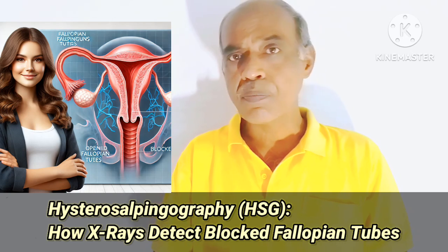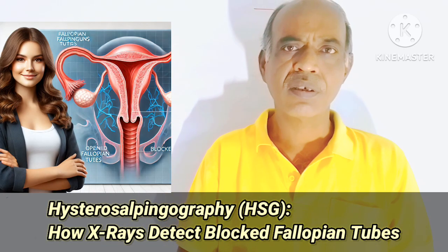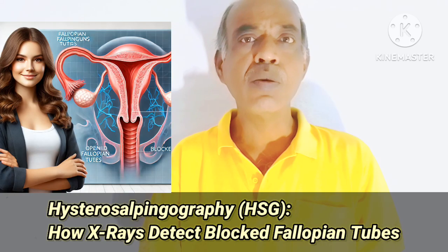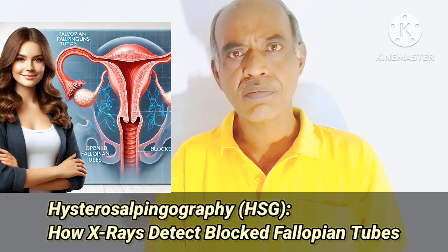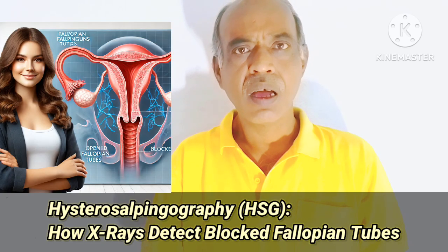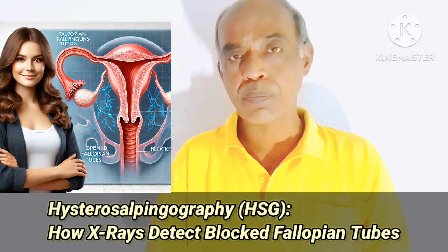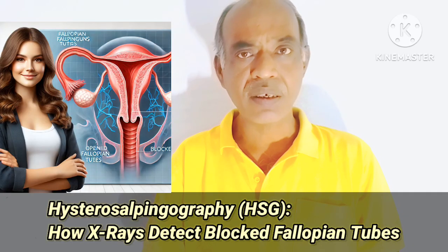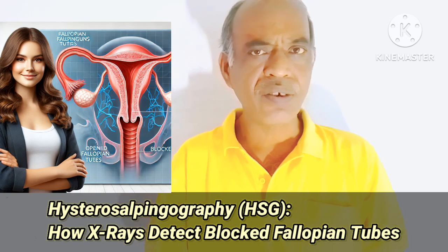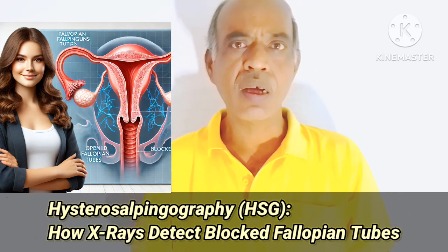So on the X-ray plate there is a contrast. When the X-rays are blocked by the bones, you get a white image, and in the case of tissues, the whiteness of the image is reduced.